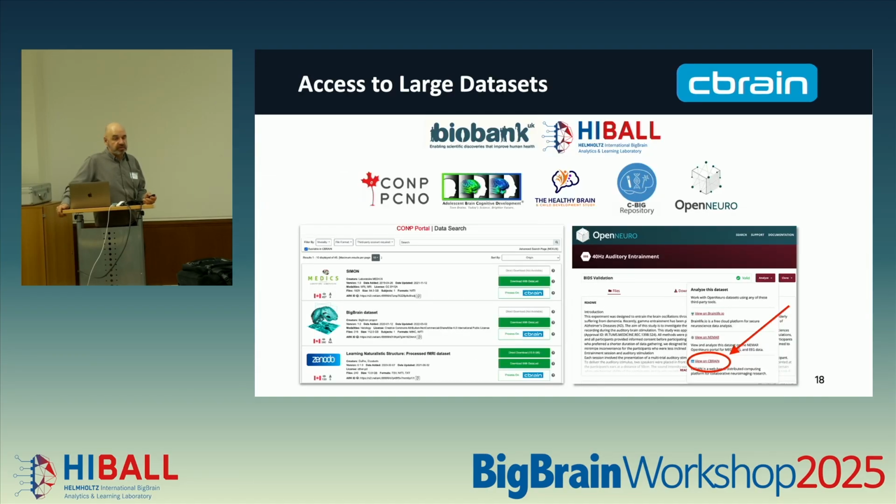And the last part I just want to mention, as I highlighted during the pitch part, is the connected data spaces. So the advantage here is you don't have to do all that separate download and management. We have different repositories connected, such as the biobank in our case at McGill, but also anything that we use from the BigBrain side as part of HIBALL. Other ones, we have other open repositories based on our infrastructure, the Canadian Open Neuroscience Platform in Canada. Other repositories also include OpenNeuro. If you go to OpenNeuro, we have a view on CBRAIN button for every single data set that's there.